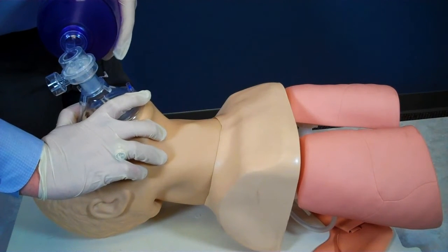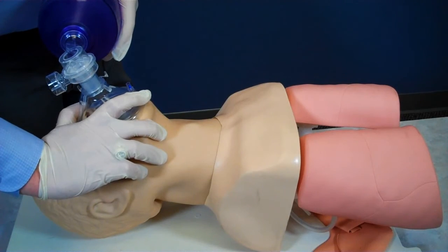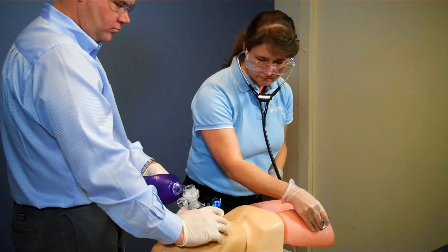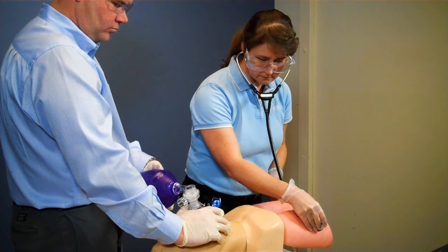I will now ventilate the patient at a rate of 10 to 12 breaths per minute. While I am ventilating, I will have my assistant check for equal chest rise and fall and bilateral breath sounds.